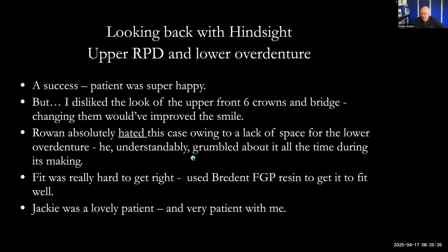Bryn, I've never needed to do that for a case. I have had to retrofit crowns into existing partial dentures. I think we would probably do a scan of the original coping of the cast that we have, and then make it to fit, and then either allow it to seat or use FGP resin.